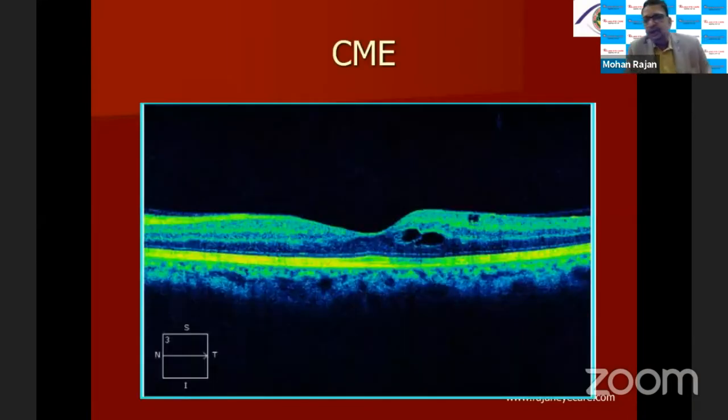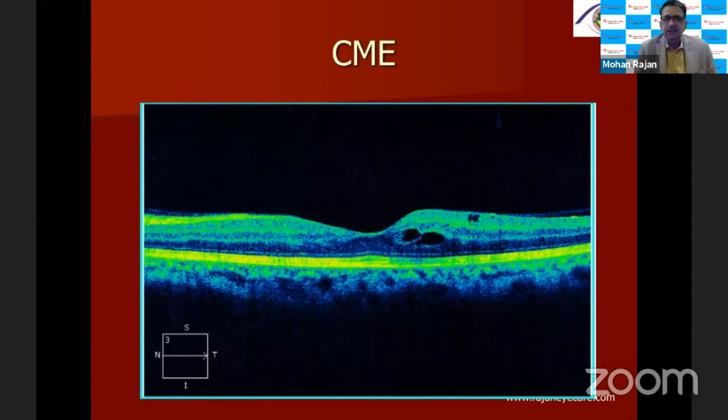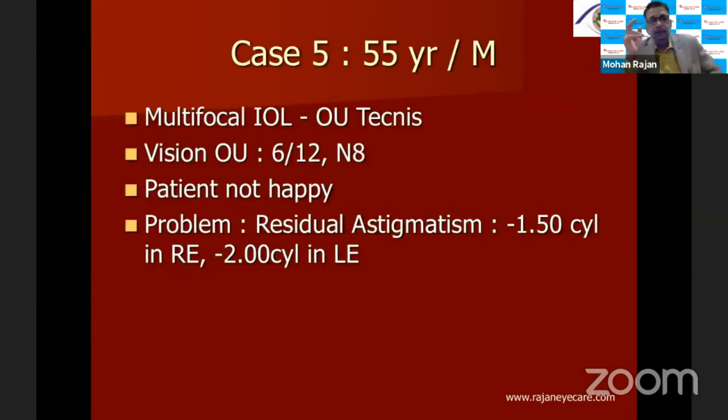Always do an OCT. When you do an OCT, you can see there's a CME, a subtle CME which can be missed by a clinical examination, either by a 90 diopter or a 78 diopter, whatever it is. The OCT can pick it up. So once you put the patient on NSAIDs and topical steroids, the patient became all right, and the patient became happy as well.